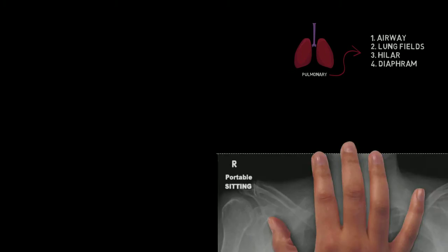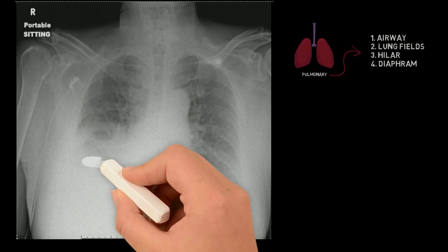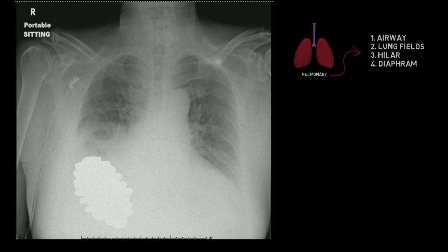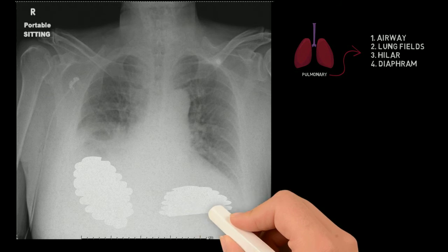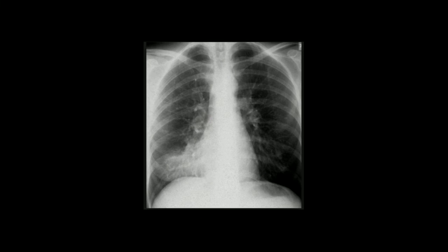You can see how the structures we just reviewed look very different in this example. Let's start with the airway — it still looks open and midline, but look at the lung markings and the costophrenic angles. The amount of that patchy density or white fluffy fuzz is significantly increased and obscures the diaphragm border and more than half of the lung fields. The cardiac border and the costophrenic angles are also not seen. This patient has pneumonia, pleural effusions, and likely cardiomegaly.